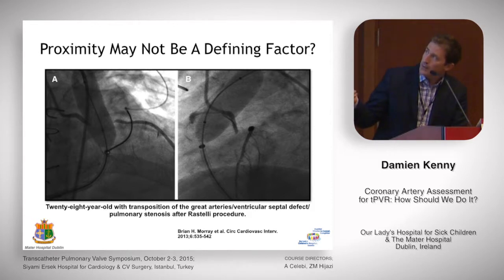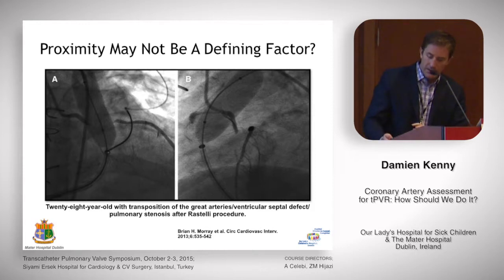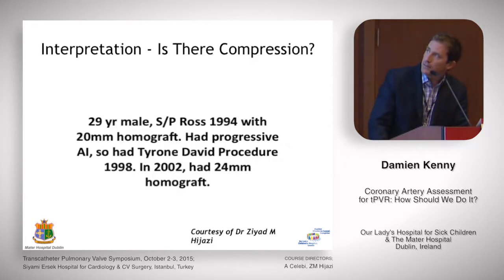And when we look in the lateral, again, it looks as if the compression that's occurring here is actually far away from the balloon, but compression of the coronary is not necessarily related to proximity. I'm not sure why I put this slide up because it basically makes things even more confusing, but I think it's important to be aware of the point that proximity alone is not enough reassurance and that serial testing is an important part of this evaluation.